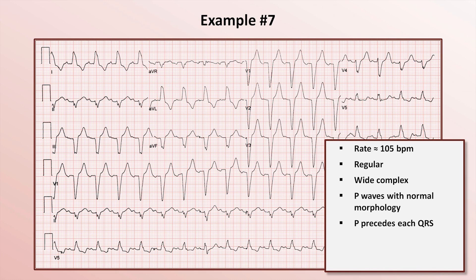The PR interval is constant and less than 200 milliseconds. Putting everything together, this is sinus tachycardia. So why are the QRS complexes wide if the rhythm is not ventricular? Remember the four causes of wide QRS complexes besides a ventricular rhythm: bundle branch block, pre-excitation, class 1 antiarrhythmics, and profound hyperkalemia.